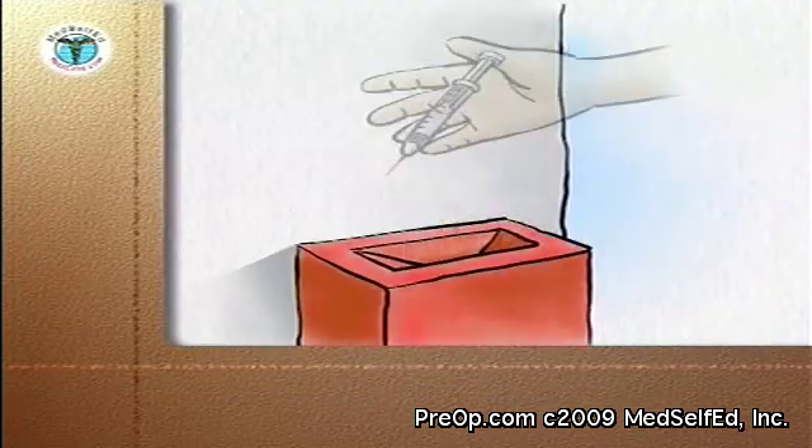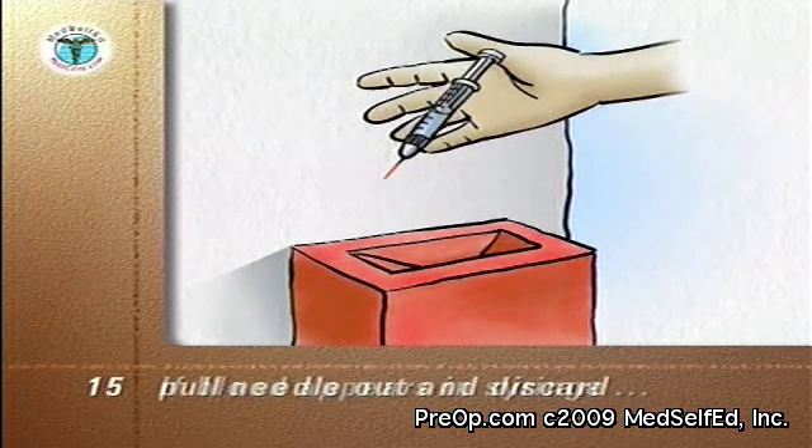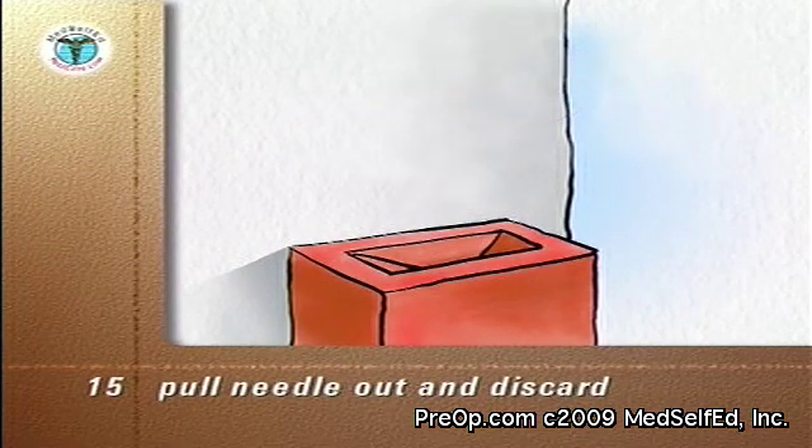If during the injection blood does appear in the syringe when you pull the plunger back, pull the needle out and discard the syringe, needle, and medication into your sharps container. And start the whole process again.